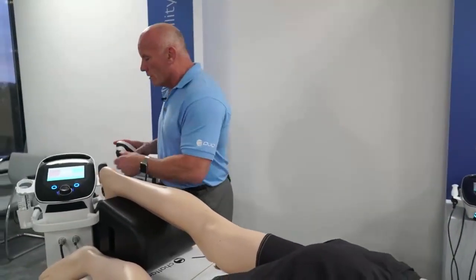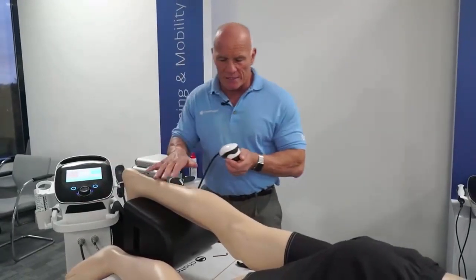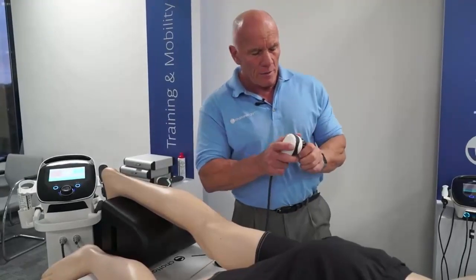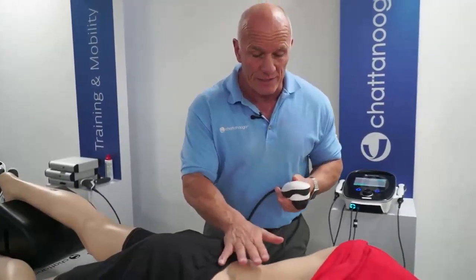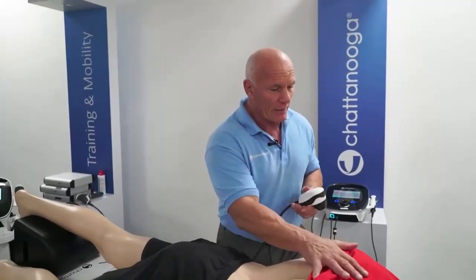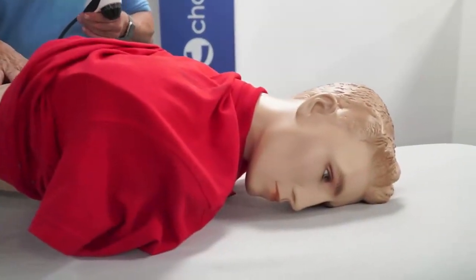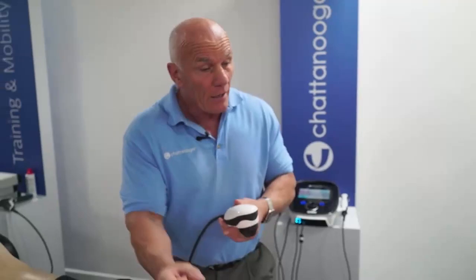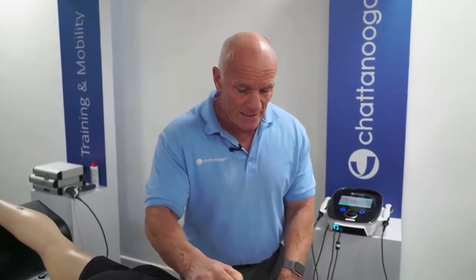On the old V actor, that's where we had to stop. We can also use that range, I should say, to prepare somebody for shockwave. I've had patients seriously where anywhere that I've touched them on their back, she was in agony. I'm not going to be able to go straight for shockwave on that. So I can use my V actor to desensitize the area prior to using my shockwave.